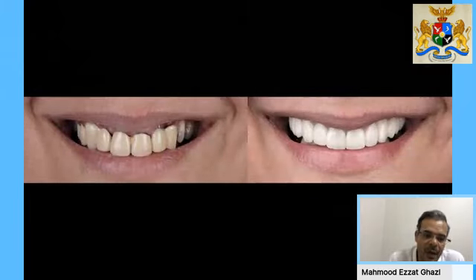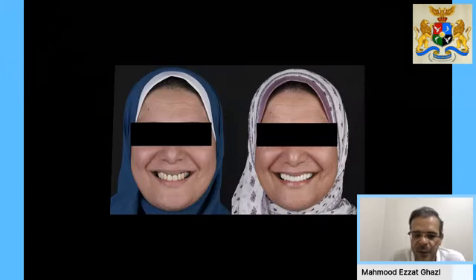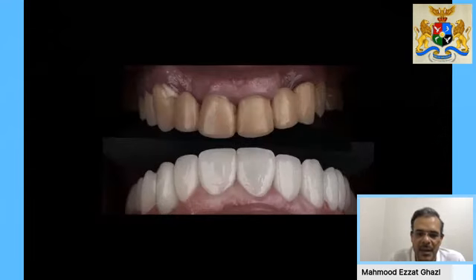This is the before and the after. As I said, our main objective was to bring everything to a higher level: the smile curve, the papilla curve, and the gingival curve, given that it was a favorable position for the patient's lip. And we were able to regenerate the papillas prosthetically without needing to go for an FP3 or a hybrid prosthesis that never looks totally natural like the patient's natural gingiva and papillas. And here are facial photos of the patient before and after, and our end result.